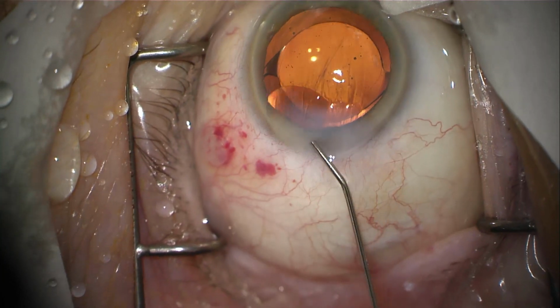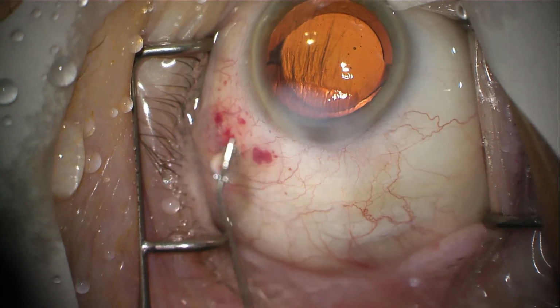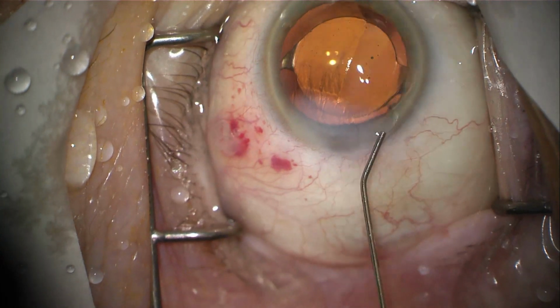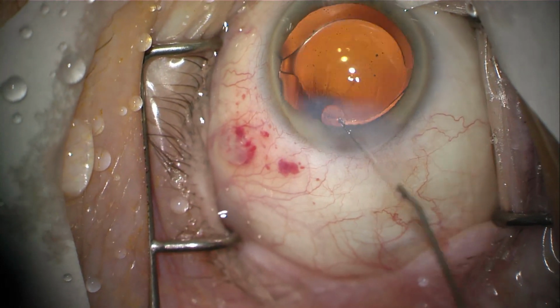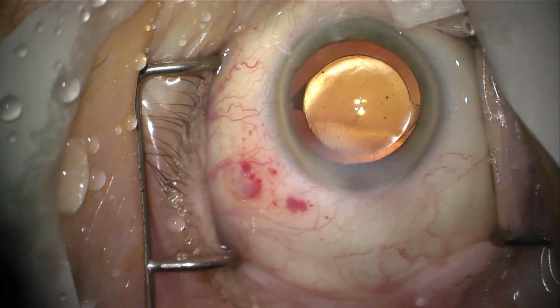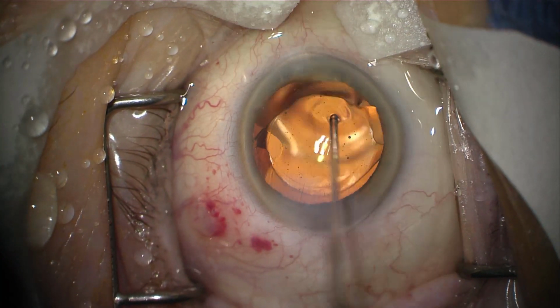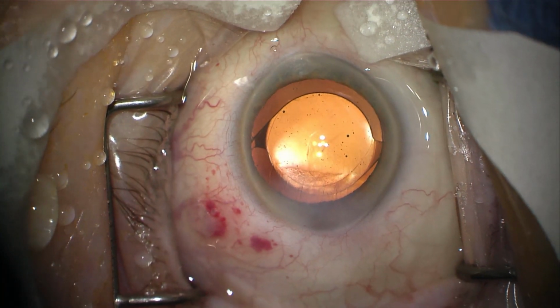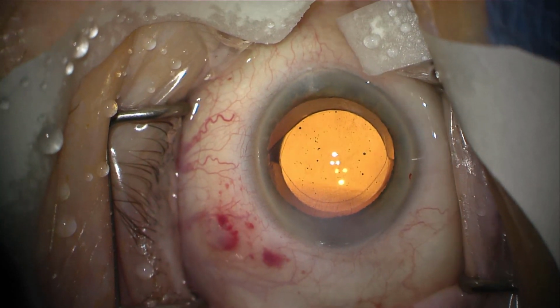By swelling, it's self-sealing the original 2.4 millimeter incision that I made to enter the eye. This seals the incision, and therefore I don't need any stitches when I do cataract surgery, because the incision self-seals by injecting the saline solution into the cornea. And as you can see, the lens implant or intraocular lens is perfectly centered.